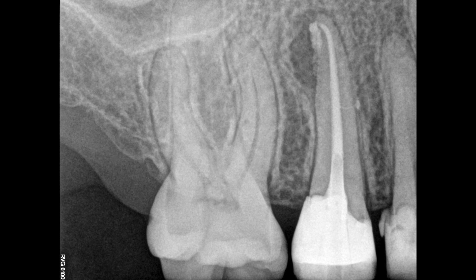Here is the final result on the X-ray. As you can see, we have a nice point of exit on the side, which is in accordance with the location of the apical translucency. On the mesial side you can also see a small accessory canal, which is also filled.